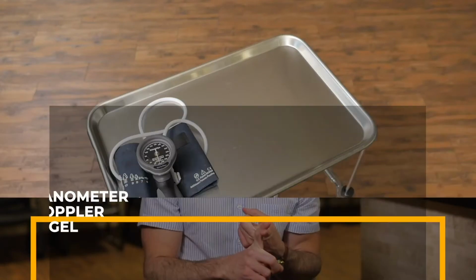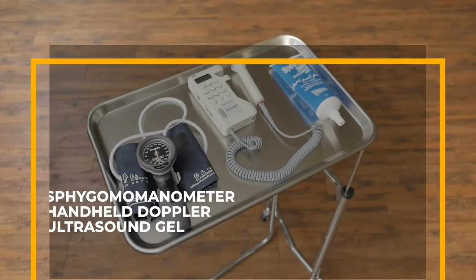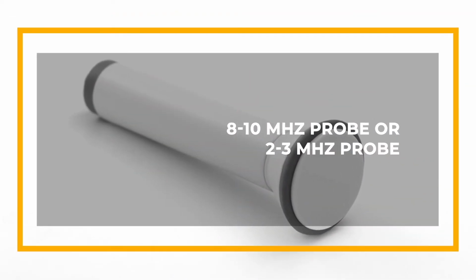So here's what you'll need to do the procedure. You need a sphygmomanometer, a handheld Doppler, and ultrasound gel. Much of the current literature does support the use of an 8 to 10 megahertz pencil probe. However, there have been anecdotal reports of the use of a 2 to 3 megahertz obstetrical probe. This is mainly just due to ease of access.